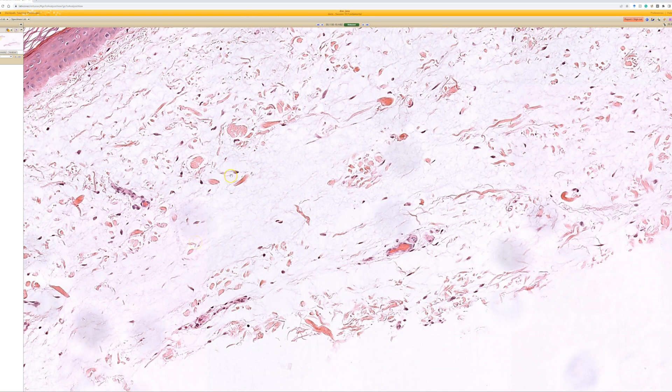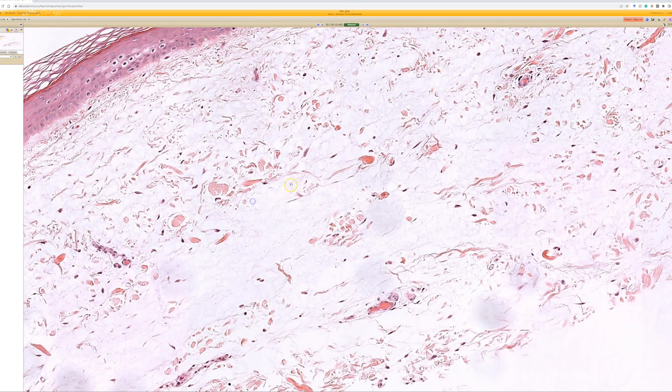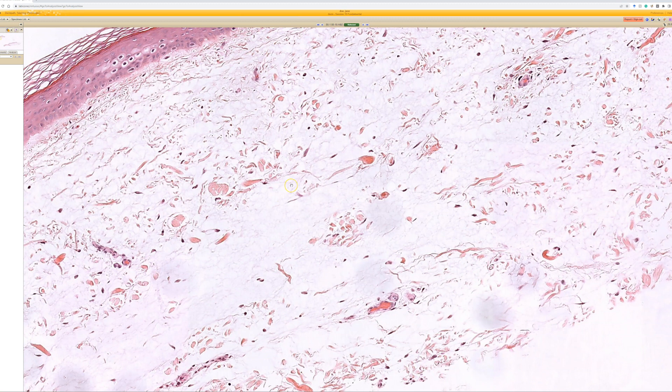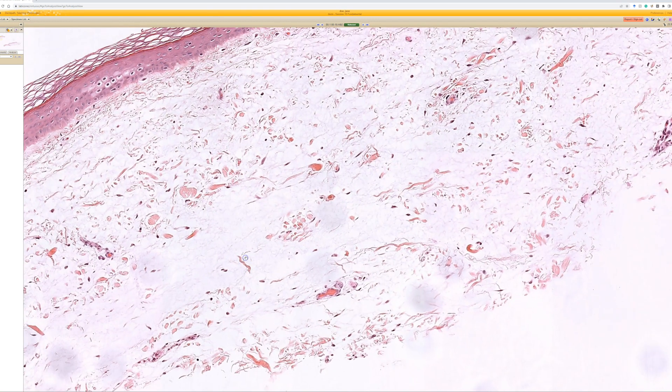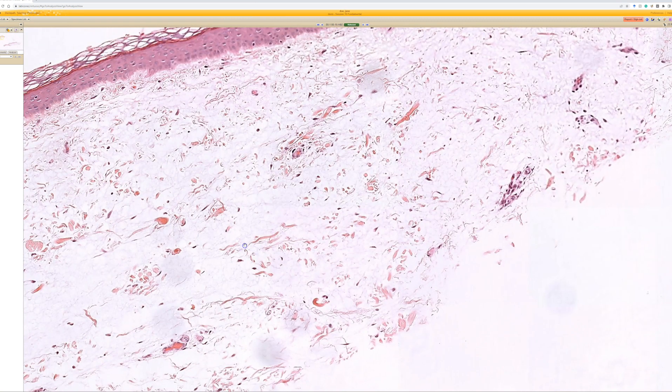and if we did a mucin stain, or probably if we just cut a new H&E from the block that's not as old, we would see the nice blue mucin. But you can tell here that it's pushed the dermal collagen apart.